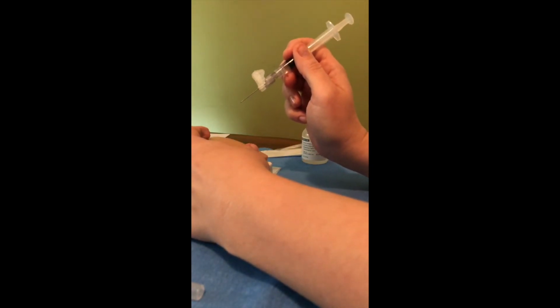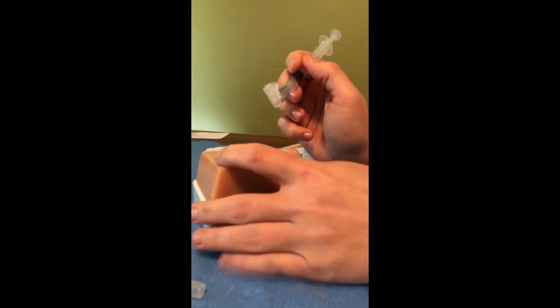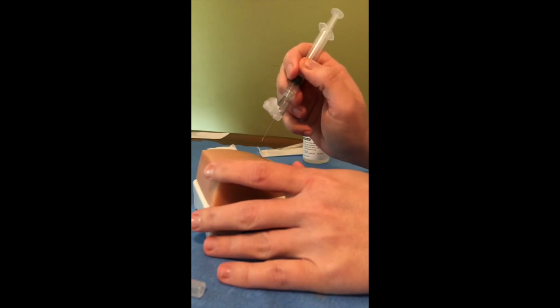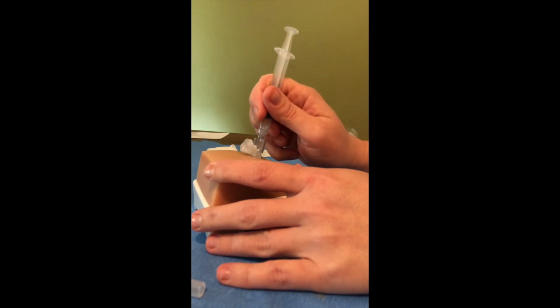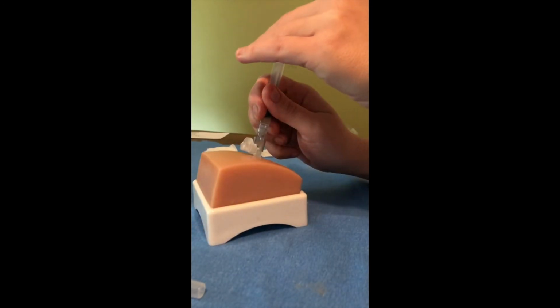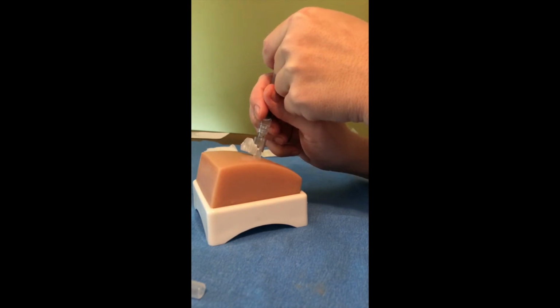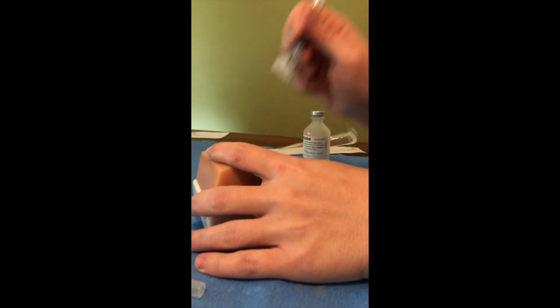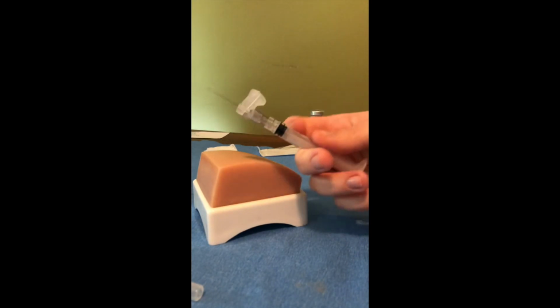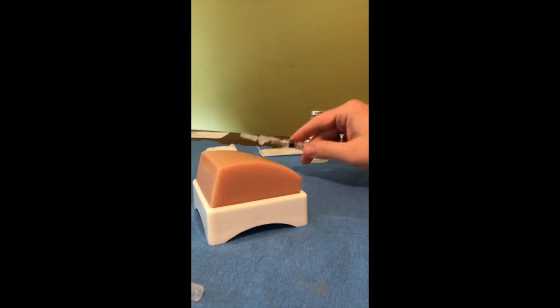You pull your skin tight. 90 degrees. You're going to go in all the way. You're going to come back here, pull back on your plunger just a little bit to see if you got a blood return. And then you're going to inject all your medicine in. Stretch your skin back out, and then pull your needle out. Your safety, all with one hand.